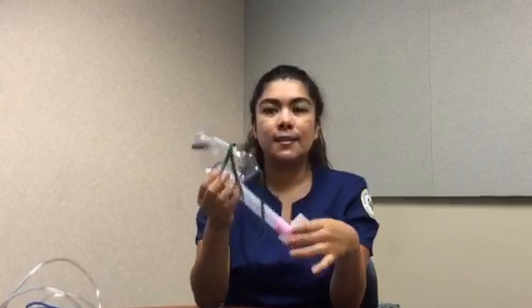And again, this is the Venturi mask. And so we've had a demonstration of all four different devices that can be used to give oxygen therapy to a patient.